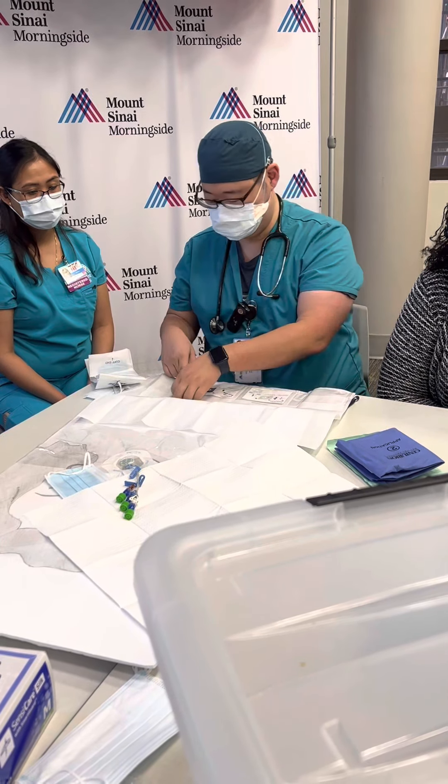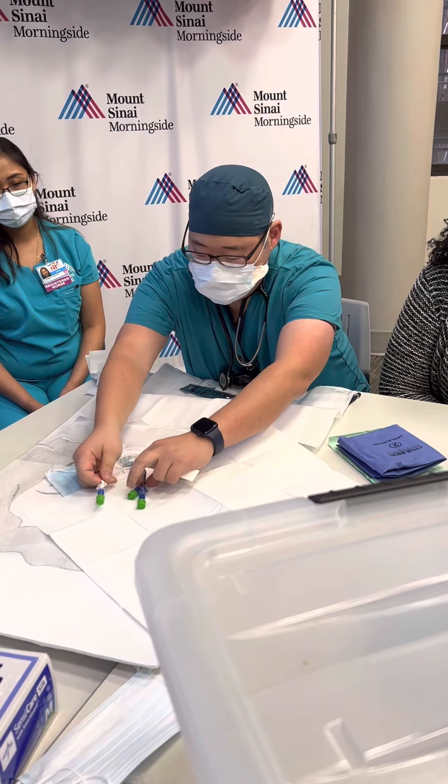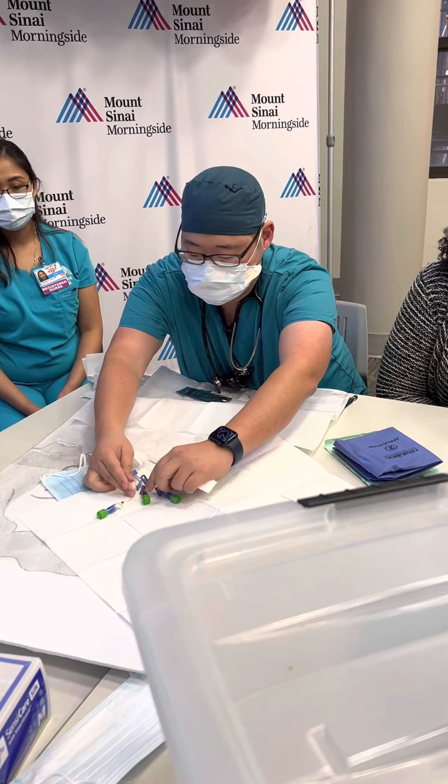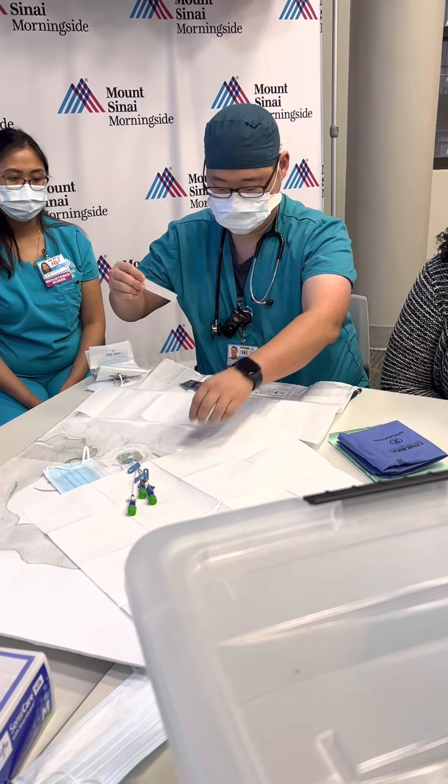There's a piece of tape that you could use to secure your lines. A central line should be sutured in place, but there is always a circumstance where the sutures are a little bit loose and you don't want to be the one to yank that out.